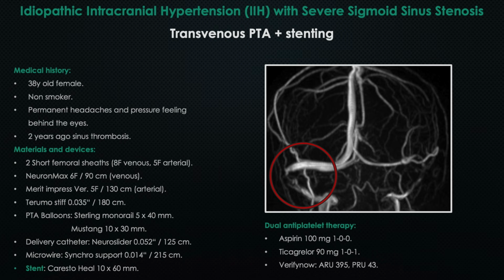Hello, dear colleagues. My name is Al-Muhammad, and today we have an idiopathic intracranial hypertension with a severe sigmoid sinus stenosis on the right side in a young female patient.